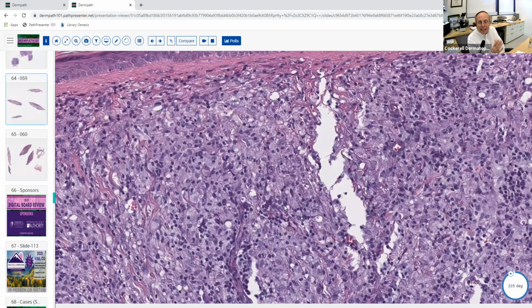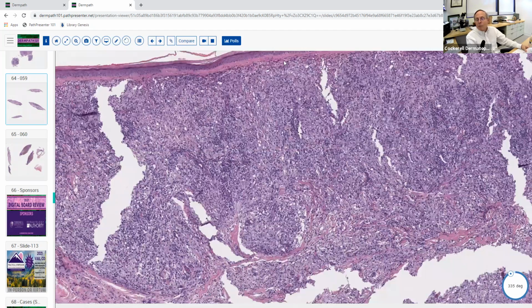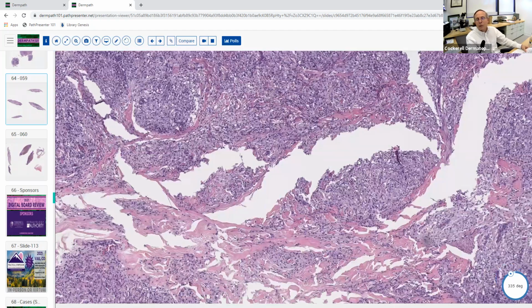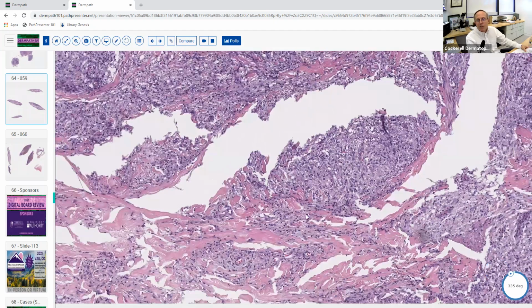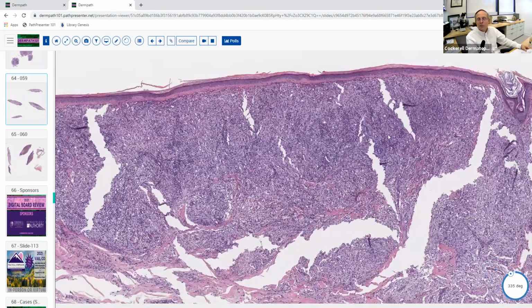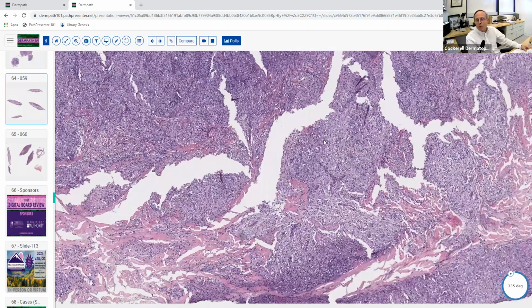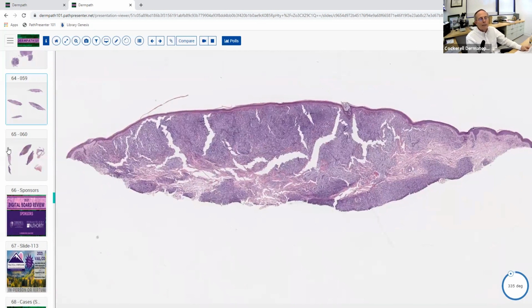So this would be Hansen's disease, and you'd want to use a Fite stain or an acid-fast stain of some sort. Hopefully you recognize that. I would recommend learning a little about the treatment of Hansen's disease. They're probably not going to ask you a lot about it, but you should know a little about the reactions associated with Hansen's disease, erythema nodosum leprosum, reversal reactions, the current regimen for treating it, and the thalidomide indications. Make sure you know just enough about Hansen's that if they ask you questions, you're going to get it right.